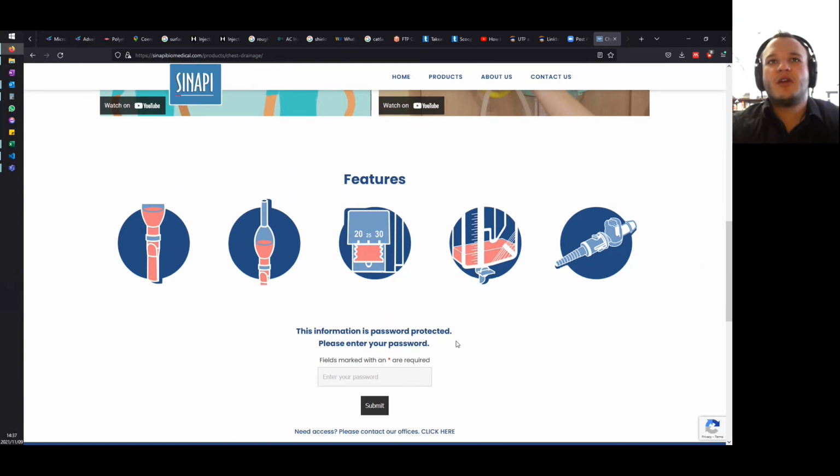Part of how we achieve this is through a custom vision system that we have developed. ANSYS assisted us with developing the system by allowing us to simulate actually what we would see inside the device.